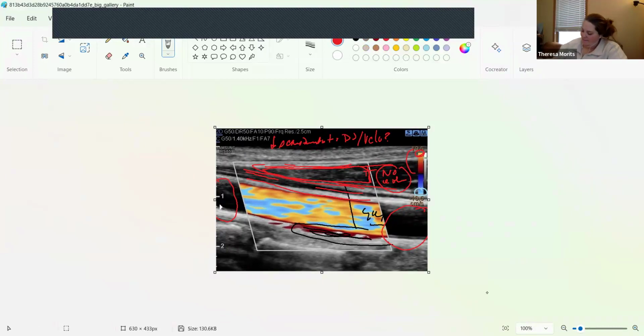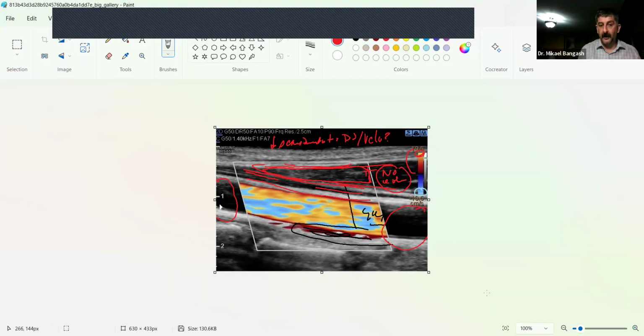Now, guys, this is just a picture. But practically, when you scan, you will actually see these gray shadows here move. That's you following the flow, and you can actually see the blood flowing in motion. That's cool to see.